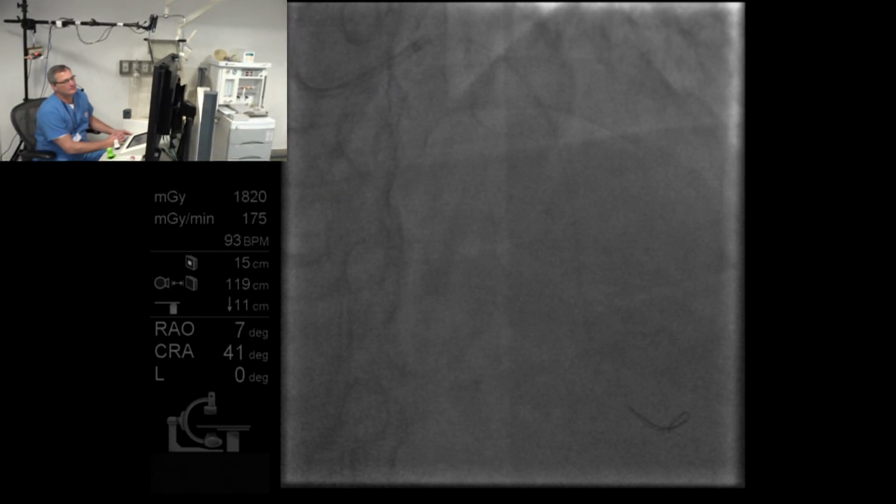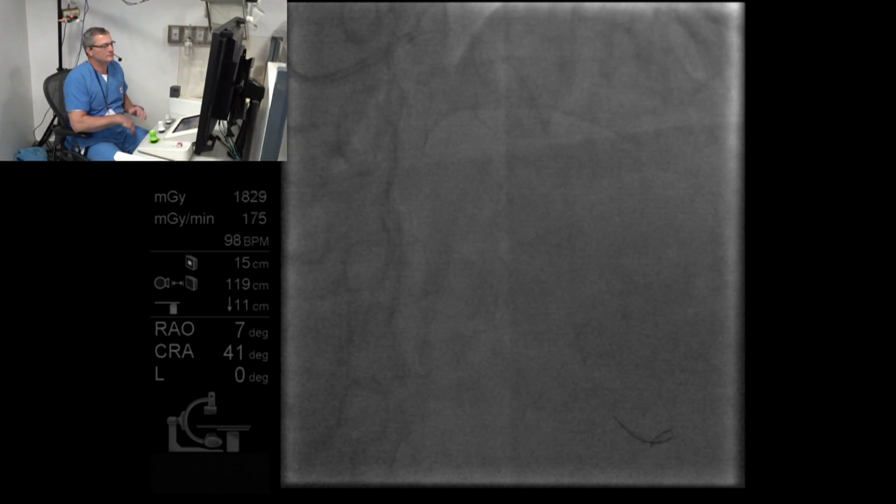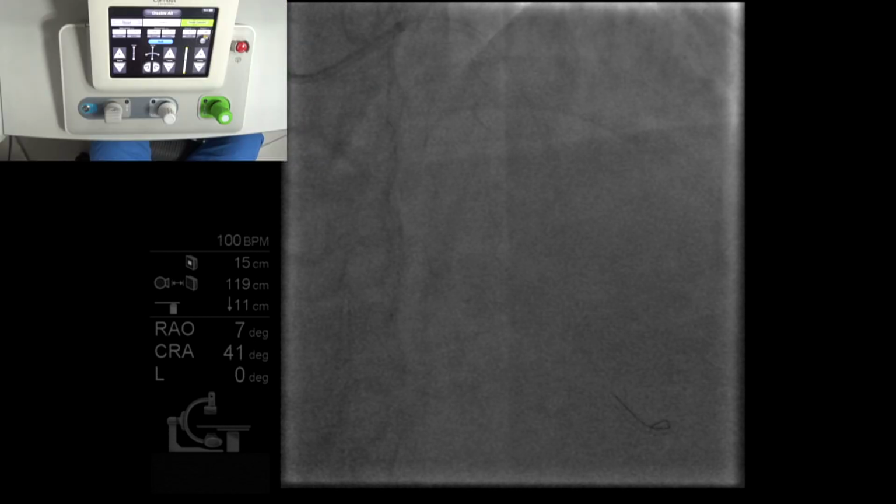Ugh, these winged balloons are not going in. Okay, the winged balloon isn't going to go. That's a bad sign. Do you think we should dilate this proximally with a 3.0? Okay. Coming out. NC Emerge 3 by 15. Yeah, that's fine.